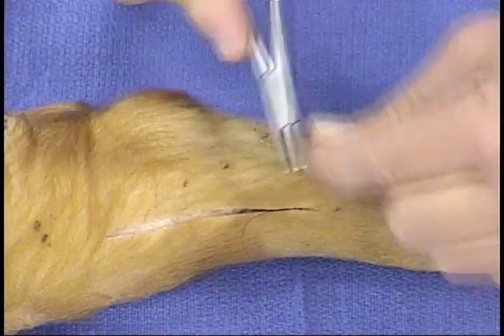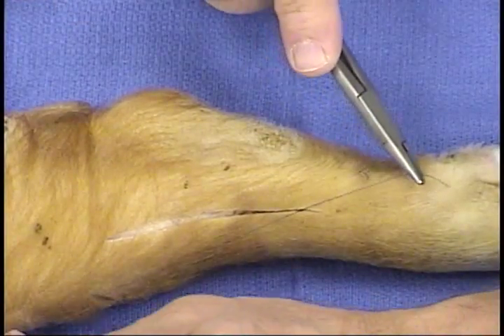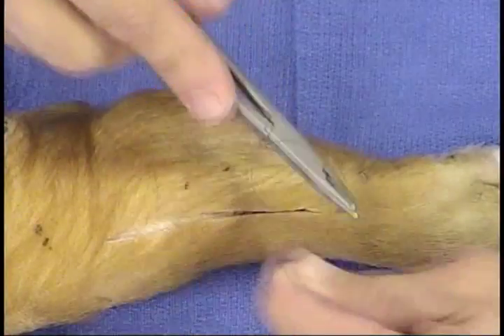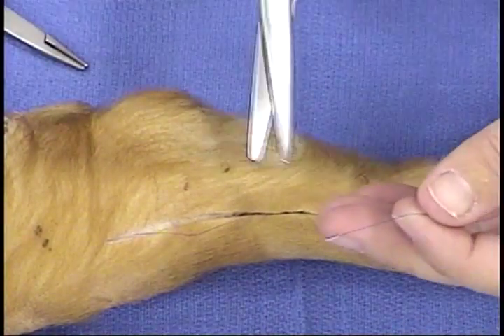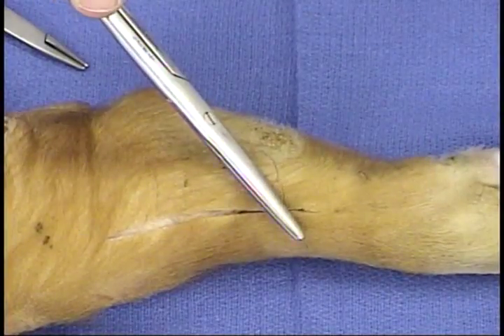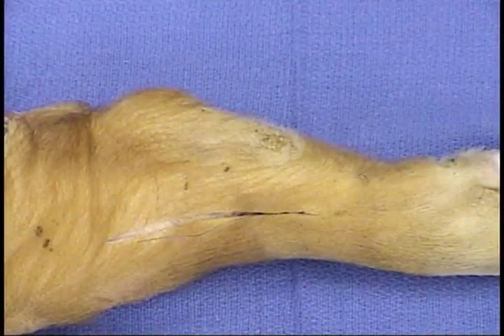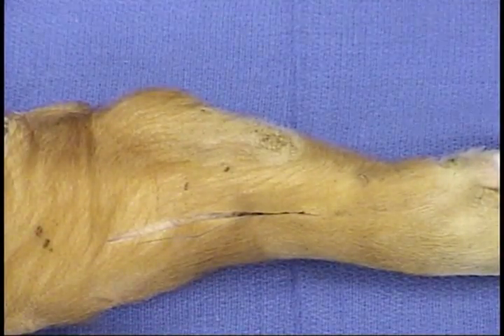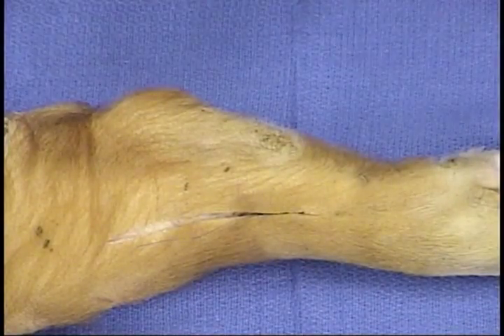This can be the starting suture as well as the ending suture. In many situations, this suture will then be the suture that the surgeon will tie to when the intradermal suture is complete. The technique will be repeated in exactly the same way at the opposite end.